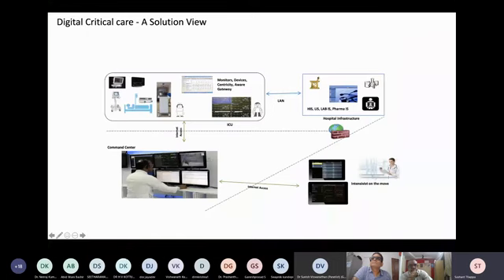Within a typical ICU setup, there is central monitoring. There are devices hooked up to a central system like Centricity through an aware gateway or different kinds of gateways that join these devices together. Once this is connected to hospital systems, like the hospital information system, labs, and pharmacy information system, this becomes one integrable system across hospital infrastructure. When you take this system and move it across different areas, it goes to a command center. For example, now I have 5, 7, 10 hospitals sending me this data. Then it can become a command center, which will have every patient's data across these hospitals. And once I apply smaller devices to this command center, the intensivist who is on the move can also get this data through an internet connection. It doesn't need hospital infrastructure. So hospital infrastructure remains till here.